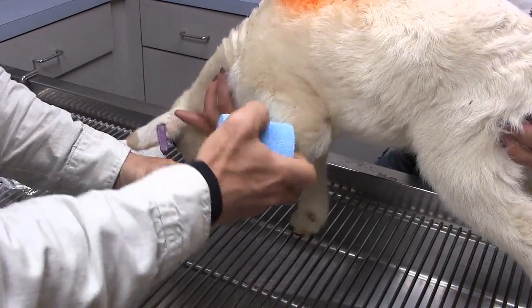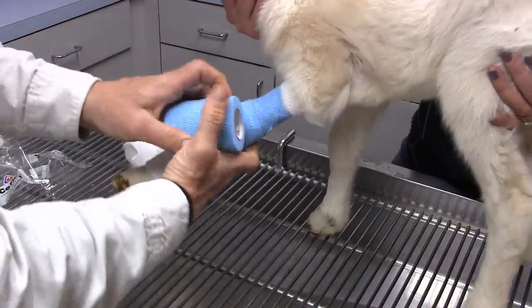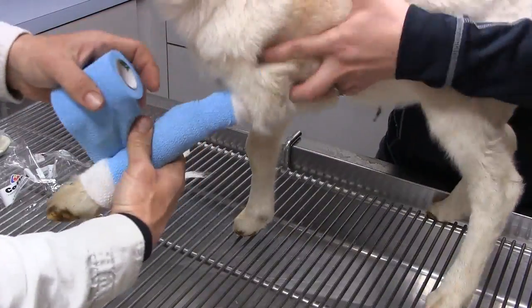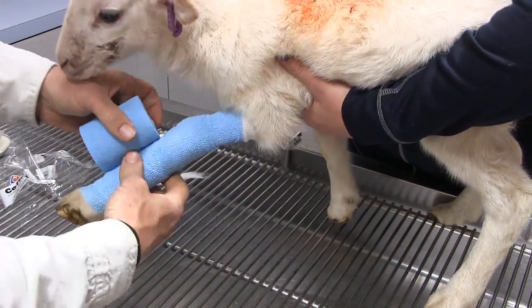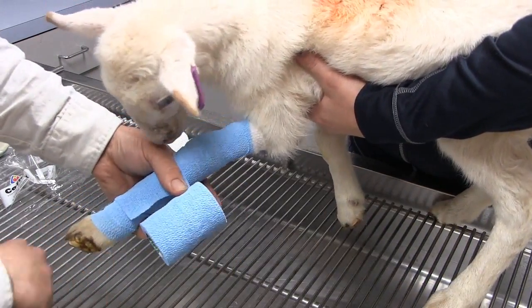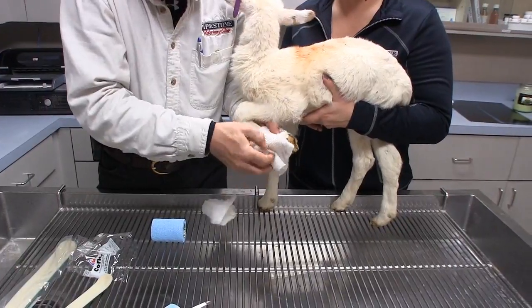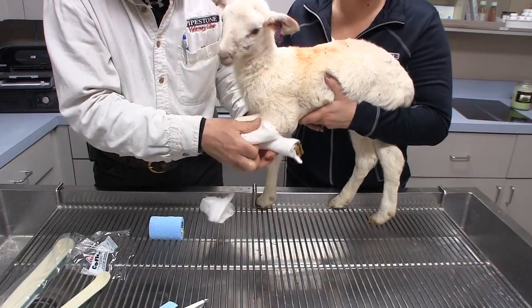We place a green splint on the back of the leg, regardless where the fracture is, below the knee. And then we're using vet wrap to basically secure the splint up against the leg. The principle of fracture repair is to immobilize the joint above and below the fracture site, and that can be accomplished simply with the cast padding, some vet wrap, and basically a green splint or potentially a popsicle stick type apparatus. We want to make sure it's padded, and we should have rigid stabilization so that the lamb can actually stand on it when it's completed.